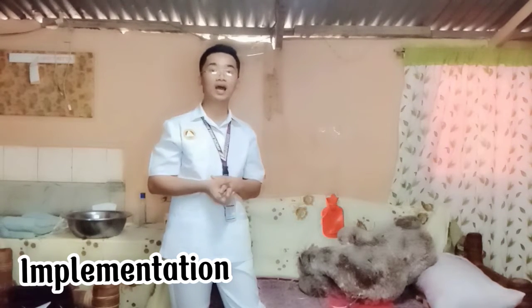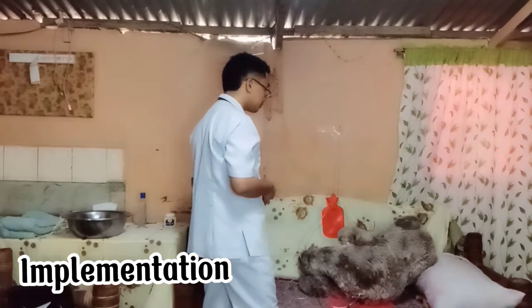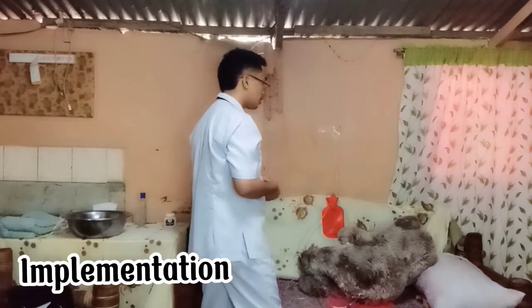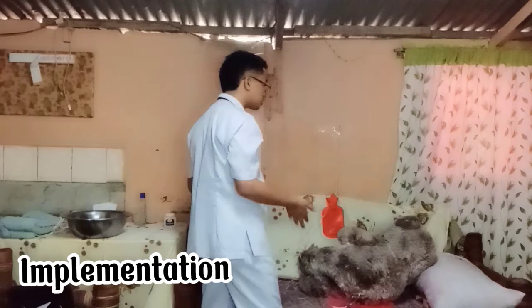So now we're going to administer the fluid slowly. If the client complains of fullness or pain, lower the container or use the clamp to stop the flow for 30 seconds. Then restart the flow at a slower rate. Okay? So, ma'am, do you feel any pain or fullness? Do you feel any irritation or discomfort with your position or the enema that has been administered to you, ma'am?